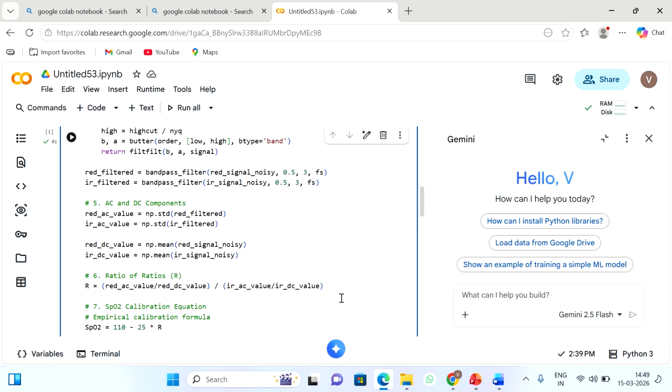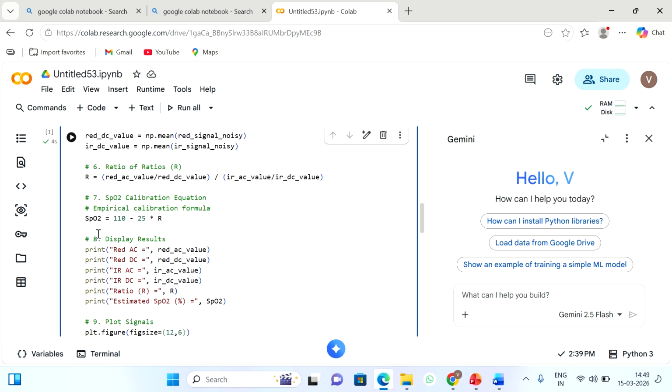Now the SpO2 calibration equation, that is the empirical calibration formula. SpO2 is equal to 110 minus 25 into R. This is an empirical calibration formula. Commercial pulse oximeters use experimentally derived calibration curves. So the typical output is around 95 to 100%. Now we display the results with print: red AC is equal to red_AC_value, which we have already determined. It displays the AC value, DC value, ratio R, then the estimated SpO2.